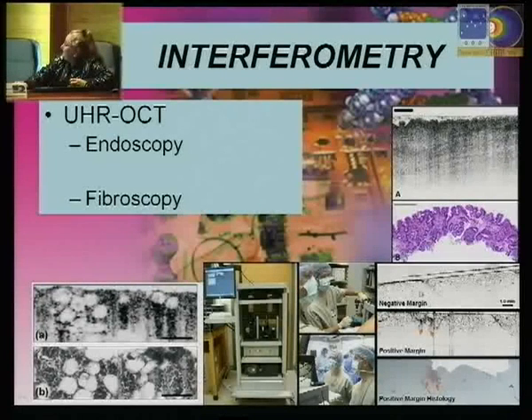For example, in here, you can see if the area of breast you are cutting in a breast surgery is free or not of tumor. In here it is free of tumor, therefore there is no problem, you can cut. And in here, the area has a tumor, therefore you cannot cut. And this is the histological image from the area you are cutting. Therefore, you have to go further on in order to cut.